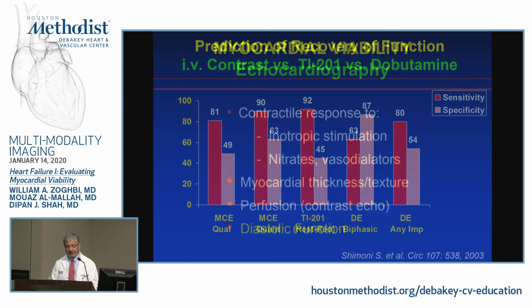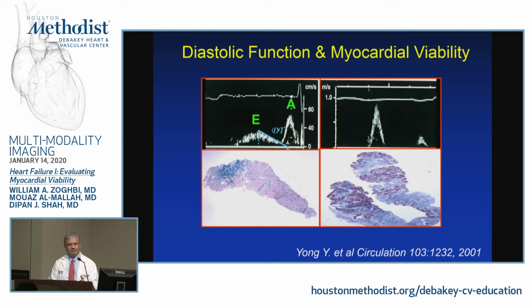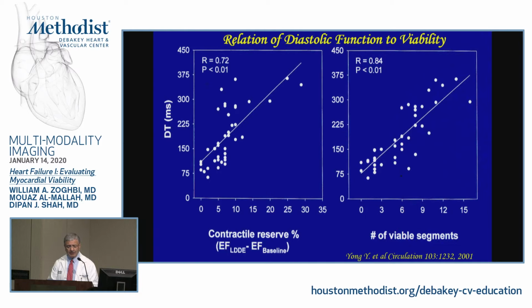I know it may be a little complex. And last is diastolic function. I know it is sensitive to pressure, loading pressure. If I see a pattern like this of slow relaxation in a bad ventricle, as opposed to a restrictive pattern, we've done some work even with biopsies, is that recovery of function is better. So you'd love to have a slow relaxation adaptive bad heart. Again, with bad ischemic heart disease, with other things that tell you that there is viability as opposed to just a cardiomyopathy. And it relates to deceleration time, which is the longer, the more contractile reserve and the more viability you have.